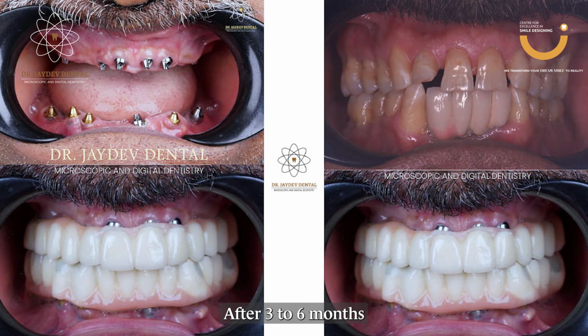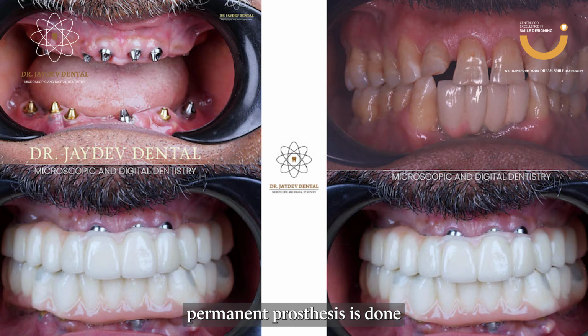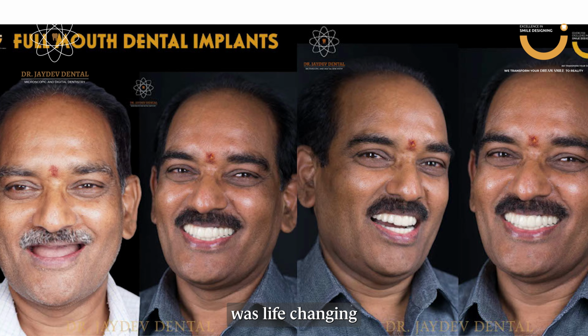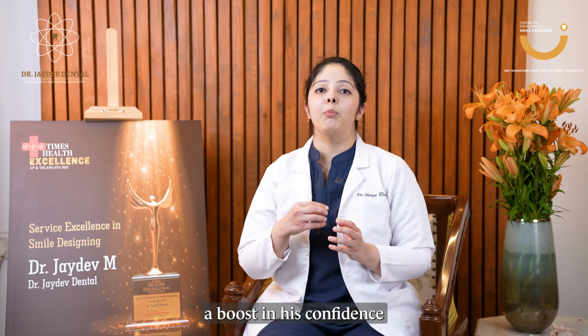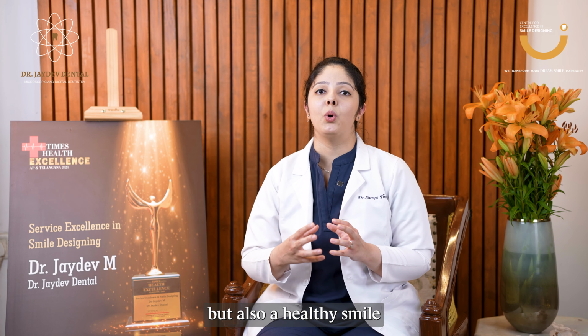After 3 to 6 months, fabrication of a permanent prosthesis is done. This wait of 3 to 6 months allows the implants to integrate with the jawbone of the patient. The transformation for this patient was life-changing. The patient was ecstatic and reported a boost in his confidence and the quality of his life. Not only was his masticatory function restored, but also a healthy smile was restored for him.